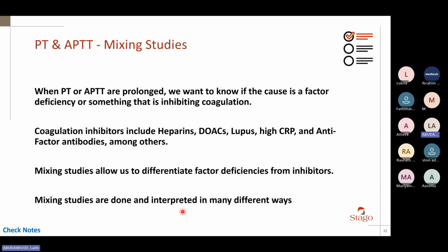So then this means that my patient sample has at least now 50% of factor 2, because 0% from the patient, 100% from the pooled normal plasma. Mix them together, you will have 50% because the 100% now is distributed over double the volume of plasma. Okay? So now what happens? I mixed my patient sample with pooled normal plasma. Factor 2 now is at least at 50%.